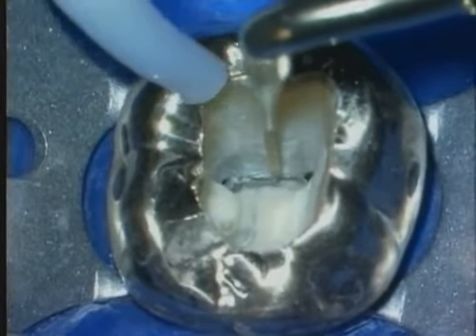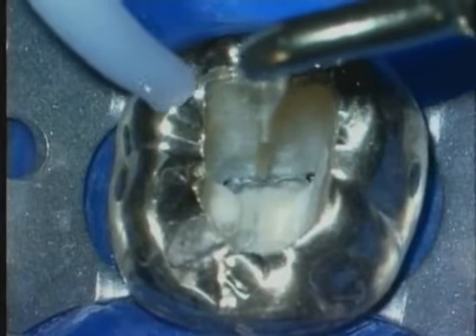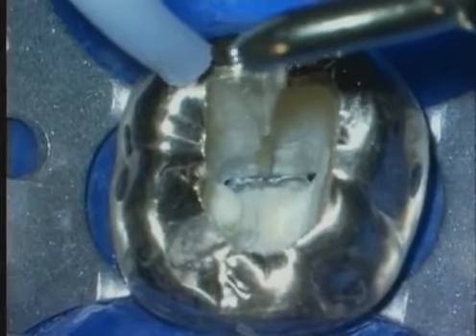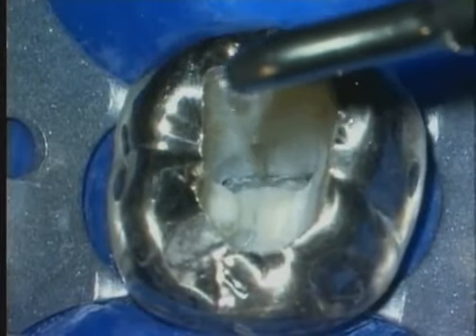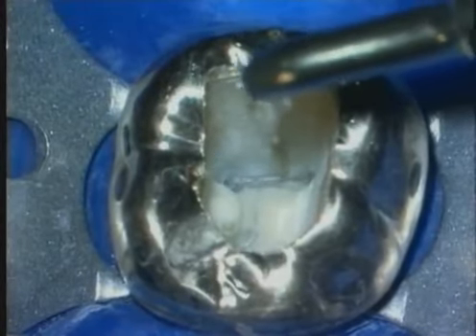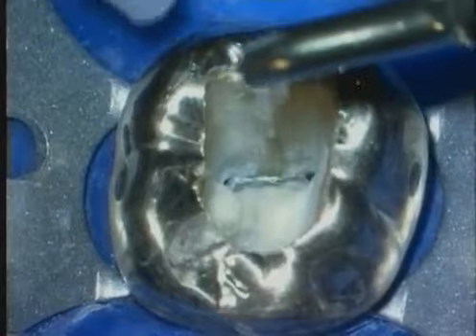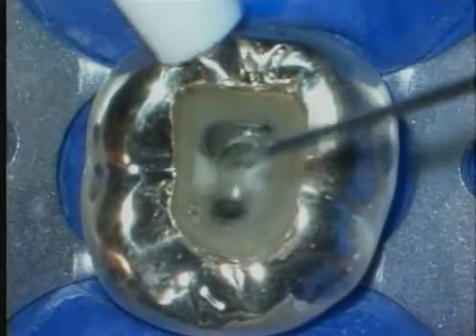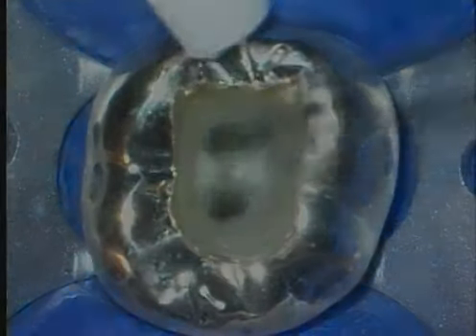Microscopes in combination with ultrasonics allow us to perform microsonic techniques. Notice the assistant using continuous air as we sand away tooth structure precisely. Notice when no air is blown into the access preparation, debris accumulates rapidly due to the cutting efficiency of the ultrasonic instrument. Use this instrument in a painting brush-like motion. Here we've uncovered an extra orifice between the MB and the ML orifices. With the tip of the file engaged, we get handle flutter. The finished access cavity can be topped off with an appropriate irrigant.